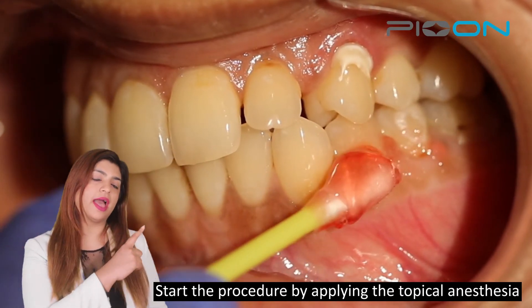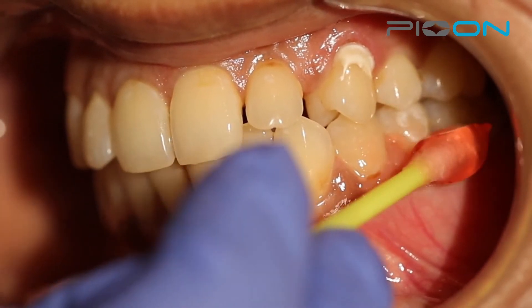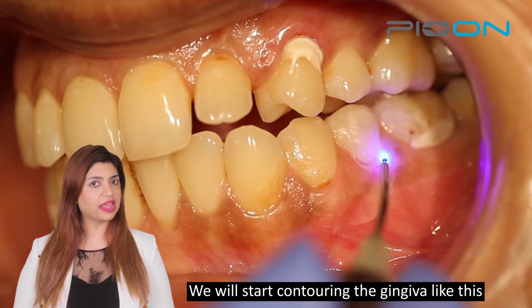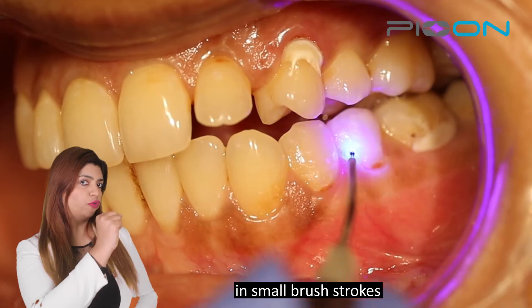We will start the procedure by applying the topical anesthesia. And we will start contouring the gingiva like this, with small brush strokes.